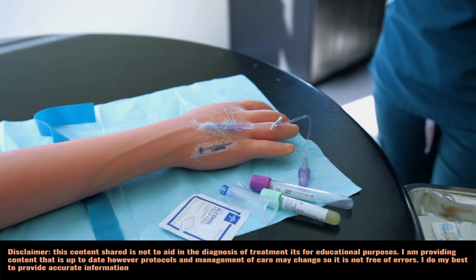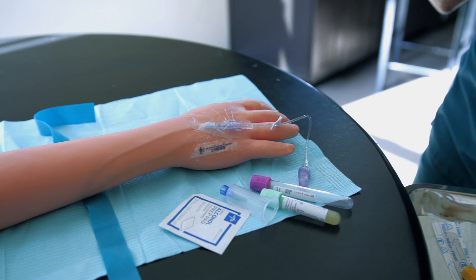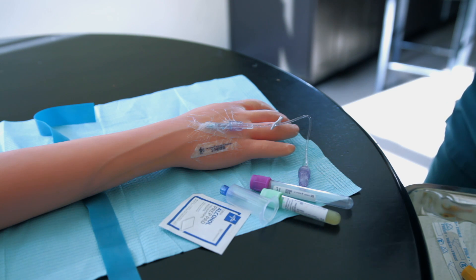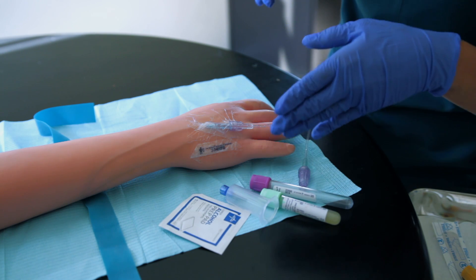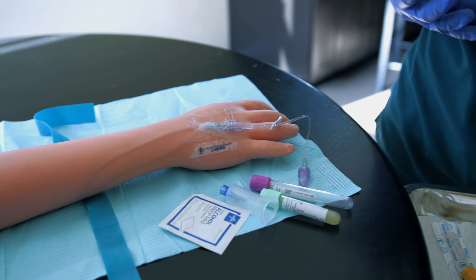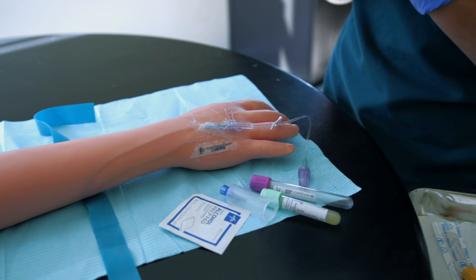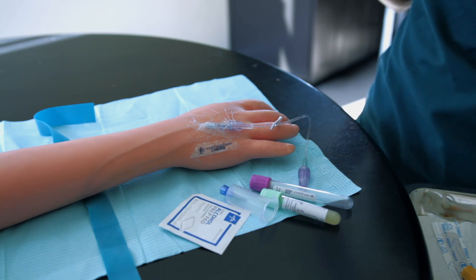In this video I'm going to talk you through how to draw blood from a patient's peripheral IV. You're going to gather your supplies: your biohazard bag, your lab requisition, the stickers, the labels, your tubes, your vacutainer, your alcohol prep, and your tourniquet. You've done your hand hygiene, introduced yourself, and you have to identify with two patient identifiers.